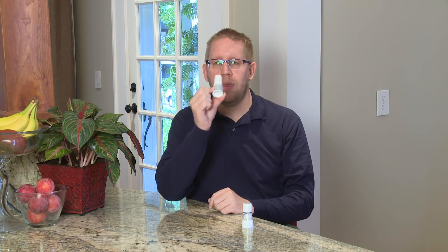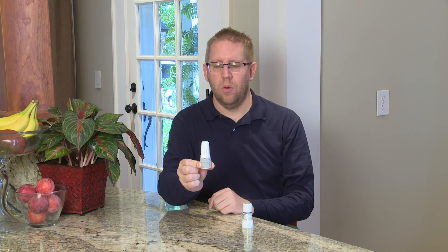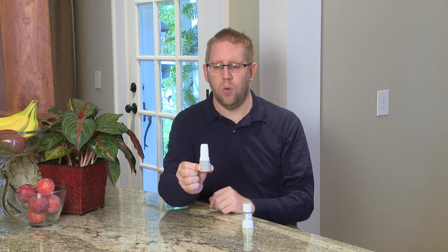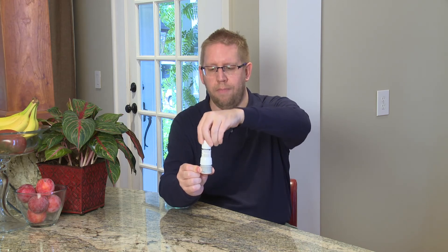You only need to breathe in one time — if you breathe in more than one time, you will not get more medicine. Hold your breath for five to ten seconds; this lets the medicine go deeper into your lungs. After you breathe out, put the cap back on your twist haler.